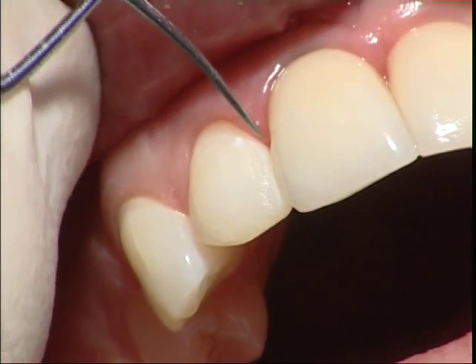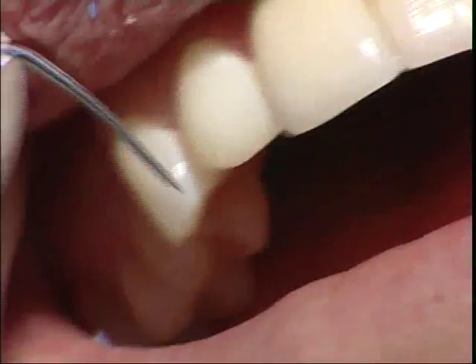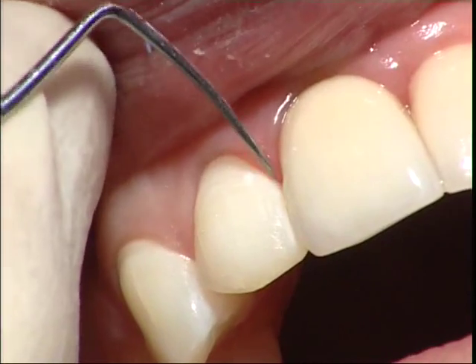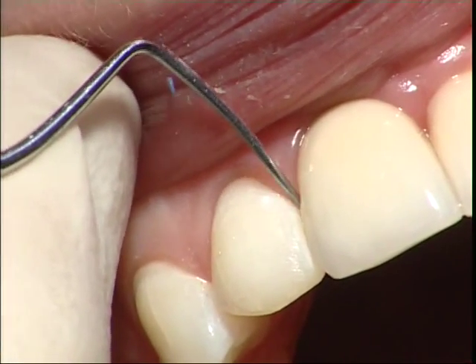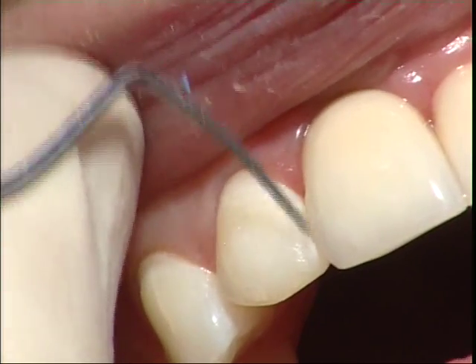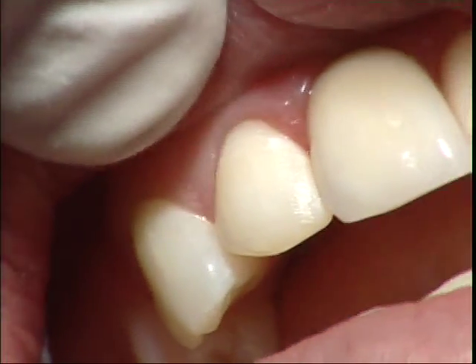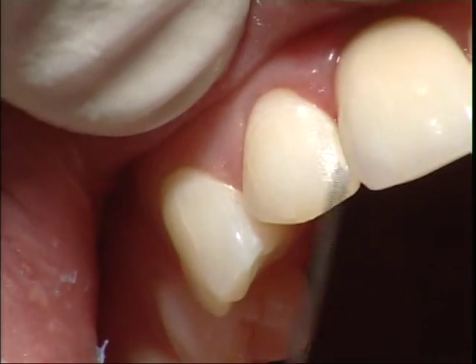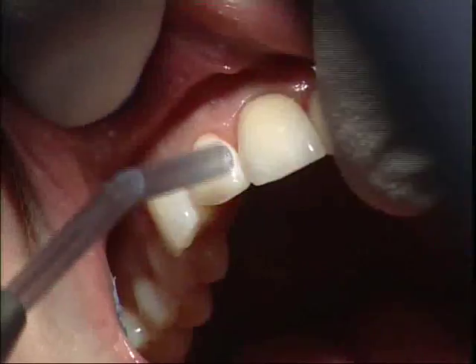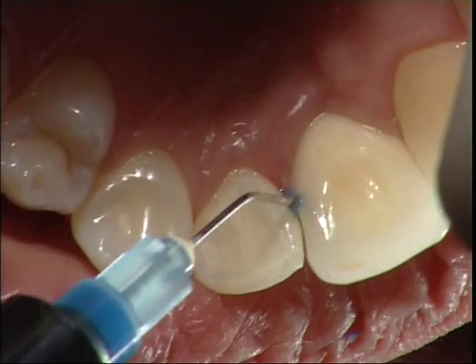Now I am going to do the temporary here. If I am pushing my temporary material up in the tray that we have produced, I might harm the papillae. So I will syringe phosphate cement on top of the papillae in this area I am pointing out, and I will let that set. That means that any material I am now pushing up here will not harm the papilla, and that means I will have a healthy papilla next time. You can see the finishing line is still buccal to the contact point.